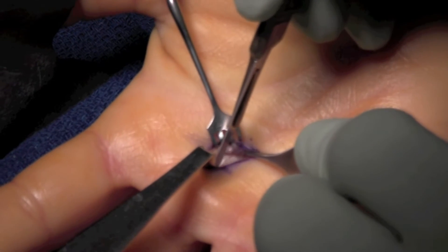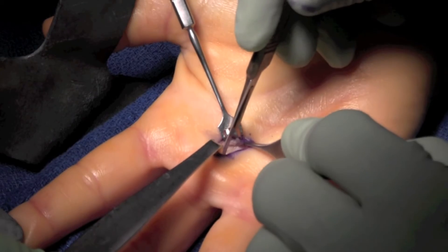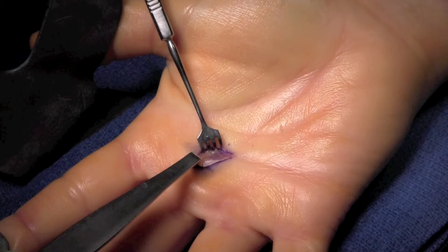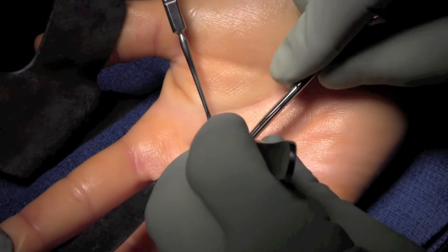The pulley is then transected with sharp dissection, typically with a knife. We open the pulley for as far as we can visualize. Care is taken not to go too deep as to injure the tendon itself.